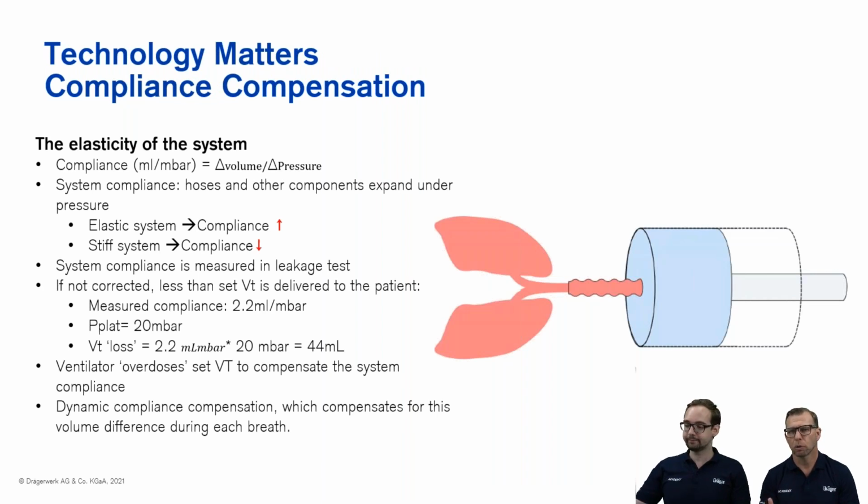Of course, we want anesthesia devices that have very low compliance, and actually even have dynamic compliance compensation. A lot of your modern anesthesia ventilators will allow for dynamic compliance compensation. Of course, we want these patients to not have to fight the ventilator at any stage.